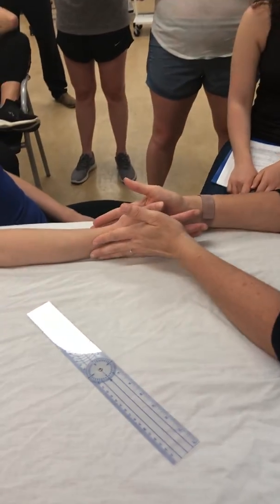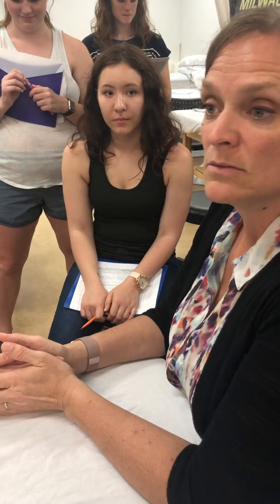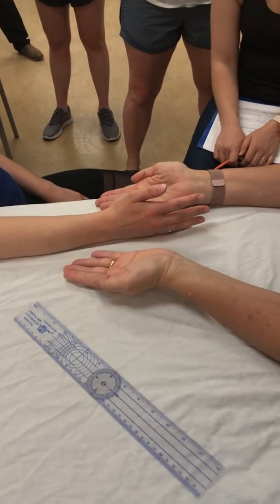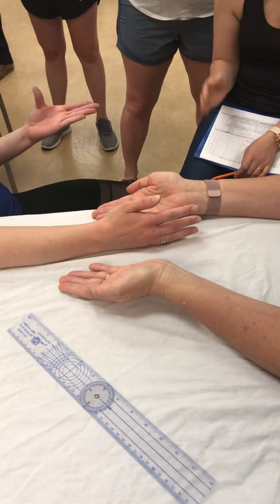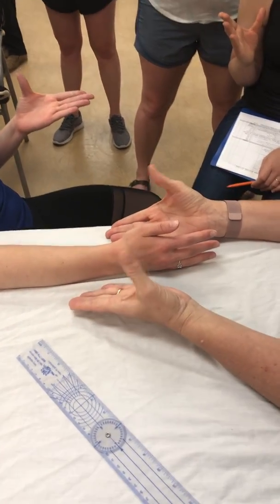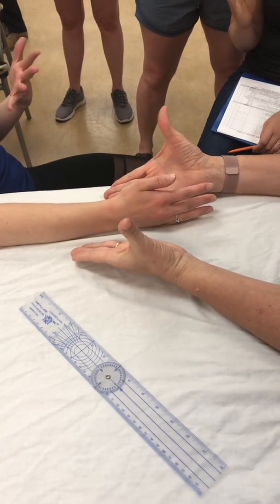Okay, so we're gonna start with thumb CMC motions. First, everyone show me what is abduction of the thumb. Up off the palm, right? So remember it's not in the plane of the hand, so it's coming straight up off the palm.